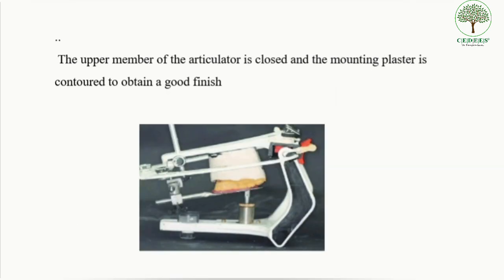A relatively thick mix of dental plaster is mixed and placed over the maxillary cast. If the cast is indexed with the remounting plate, a separating medium should be applied over the maxillary cast. Once the upper member of the articulator is closed and the mounting plaster is contoured to obtain a good finish, this is how we mount a maxillary cast.